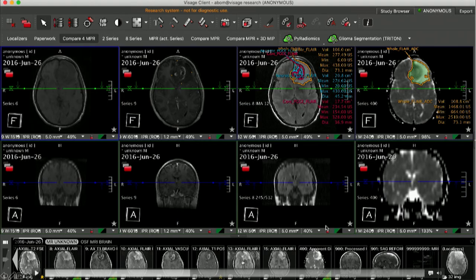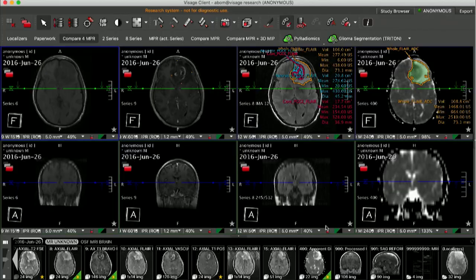Now, most of the radiology image analysis is done qualitatively, and that has been historically since the introduction of PACS and since the use of film, because we're focused on the expertise of the human eye. We are starting to enter a new era in radiology where we more and more are starting to use quantitative or semi-quantitative image analysis for our diagnosis. So here's an example of what we're doing in my laboratory.